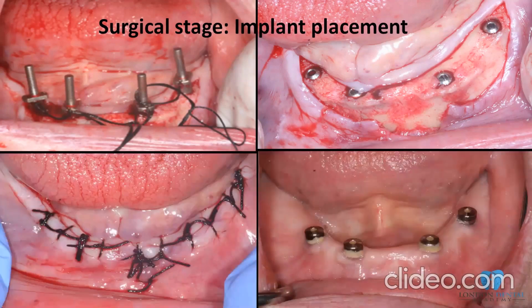You need to identify clearly the mental foramen, and those who are surgically trained never ever try to place implants without seeing the mental foramen. Computerized and guided surgery is just not enough in these cases. Please make sure that when you do these cases, you have got somebody with you, and if you are not trained to do it, don't do it. Don't bother, because the risk is quite high.